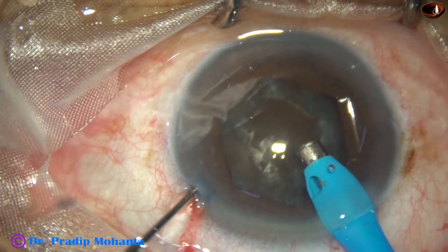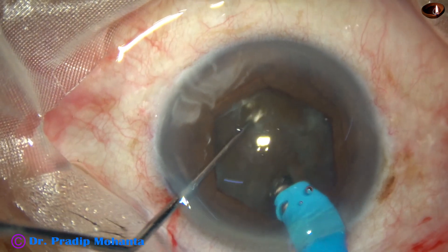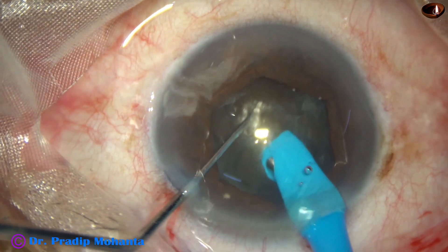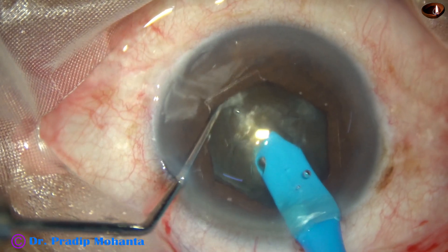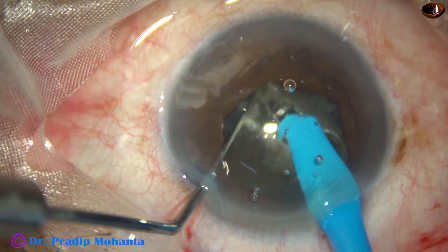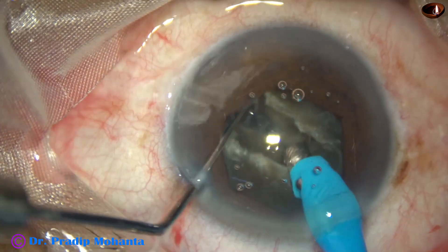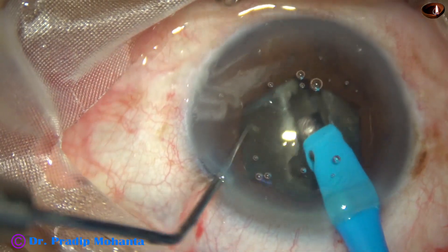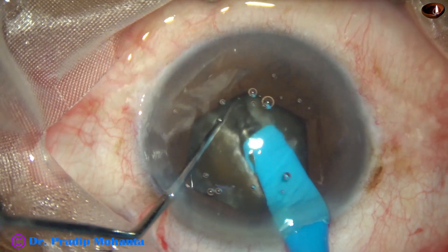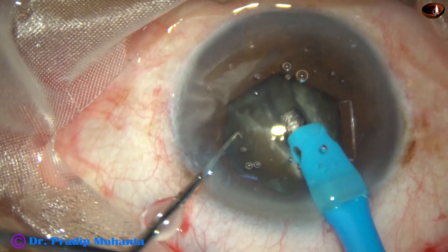I am now applying my submarine chop technique. The phaco needle goes within the substance of the nucleus, just in front of the main wound, travels through the nucleus, and full ultrasonic energy is applied — about 80 percent. The nucleus gets a very nice crack. I don't do a lot of lateral separation here; I come to the other side, rotate 180 degrees, sculpt once or twice, and I have two hemi-nuclei.